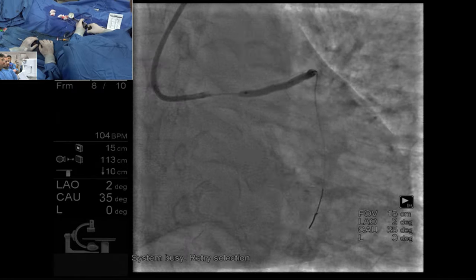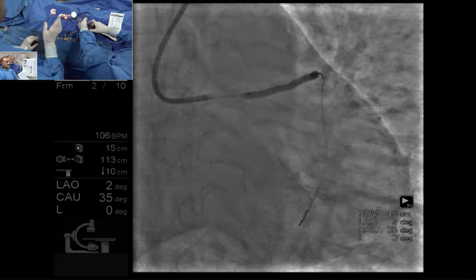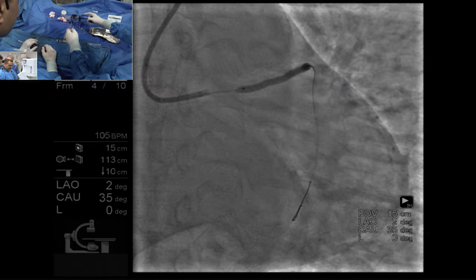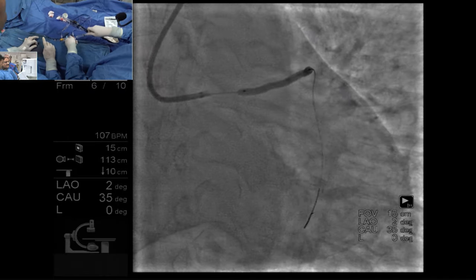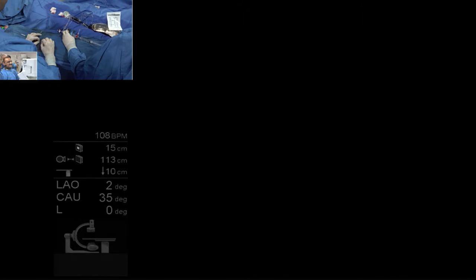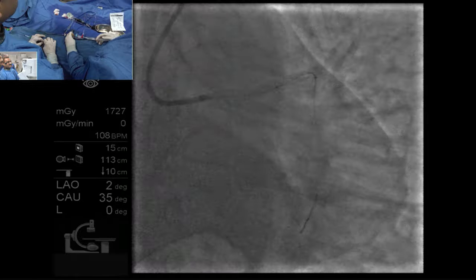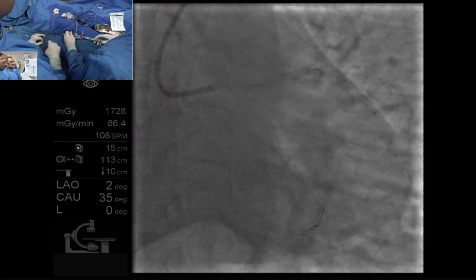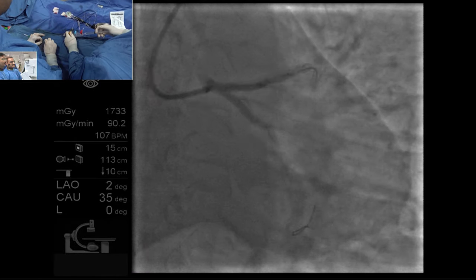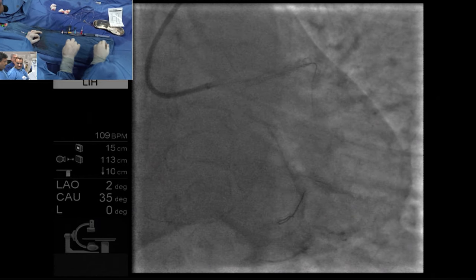You see anything anywhere there? Go to 20 and down. Well, not all of us speak to the gods like you do, Tejan. Some of us are just mere mortals. But I think this is a teaching course. So the way we're doing that, when we see a lot of calcium by IVUS, we need to do something before we implant the stent. Agreed.